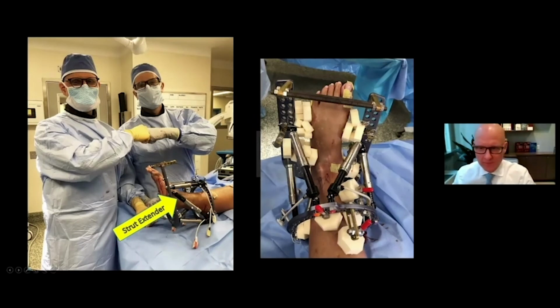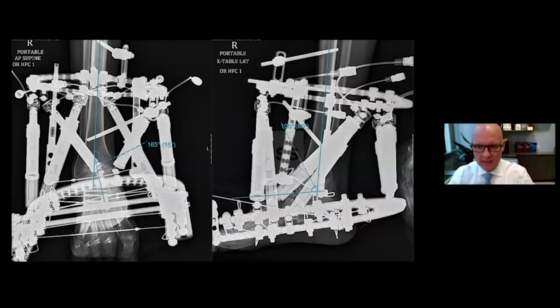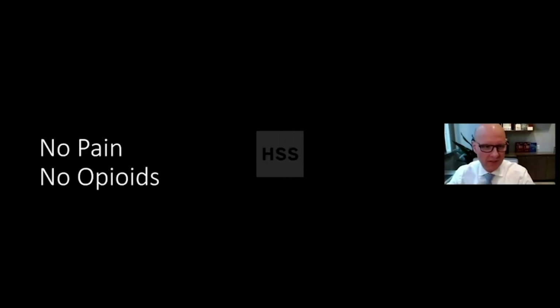Part of the limitation of the first generation was that the struts all came in one size, and if you needed a longer size, you could put an extender on it. But if you needed a shorter size, you were stuck. So your working length had to be a little further than you might normally use. U osteotomy went well. The guy's in a corrected position now. The Saltzman view shows that he has a well-aligned heel. Then we're just waiting for him to consolidate.